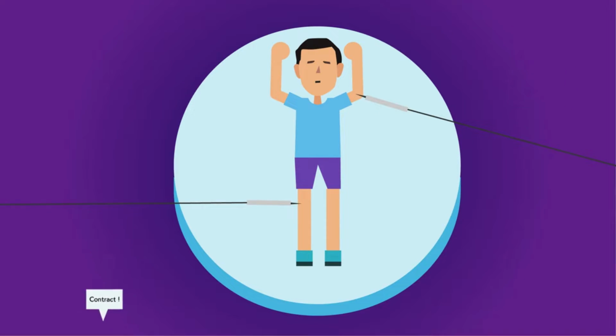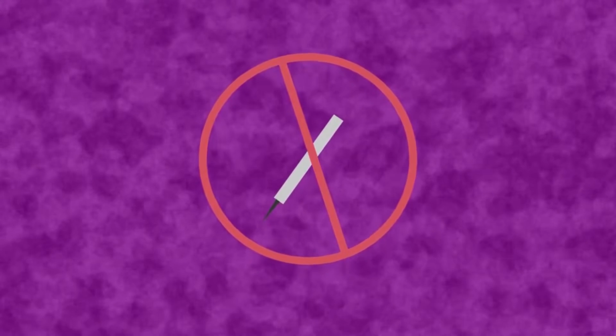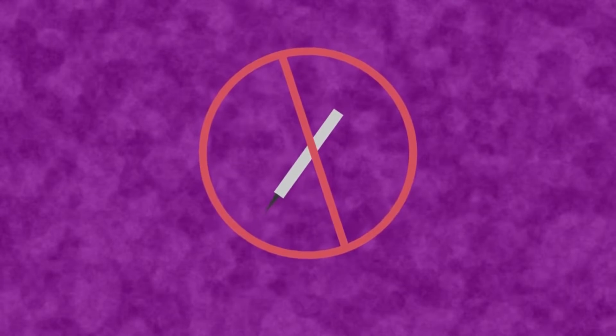In a nutshell, this is how EMGs work their magic for hundreds of thousands of patients worldwide who are suffering from neuromuscular ailments. Of course, there's no need to be so invasive. Nowadays, there's more and more research on non-invasive methods of EMG signal acquisition. The most common method involves placing an adhesive electrode, such as a silver chloride electrode, which by the way is a very popular choice for electrode type, over the area of interest.